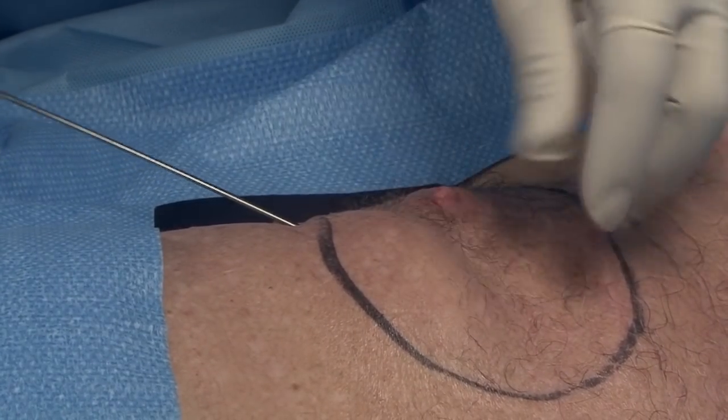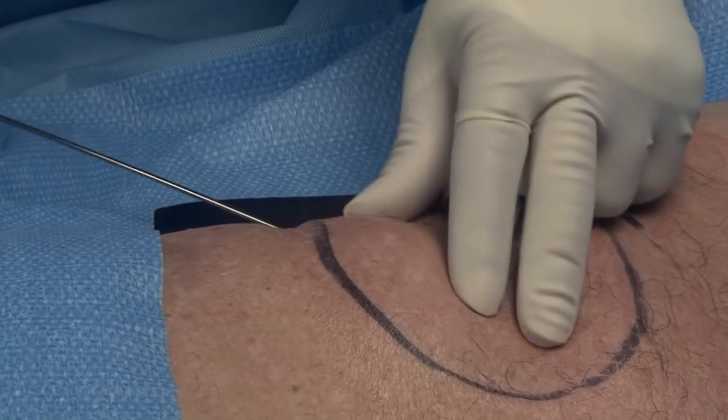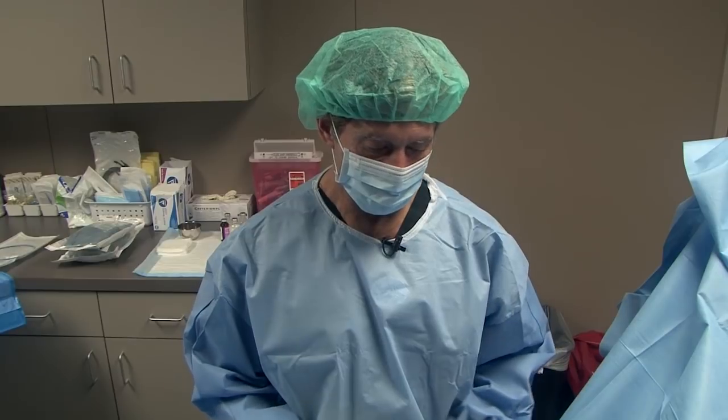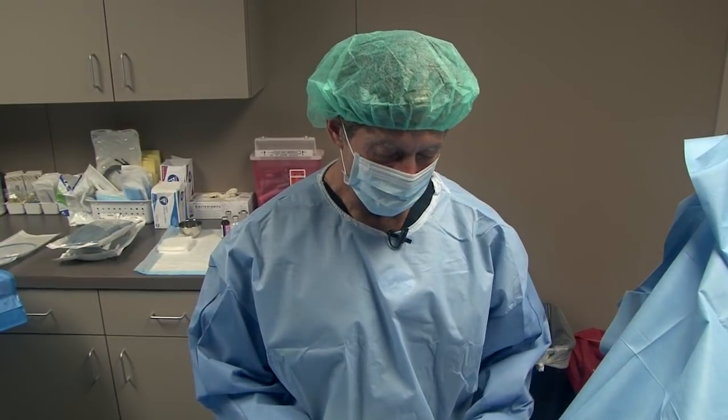As you can see, as it goes under the skin, it just swells up a little bit and that's normal. Now we have all the numbing fluid placed. We've waited just a little while for that to take effect. Now we're ready to move on to the next step, which is the smart lipo laser portion of the procedure.